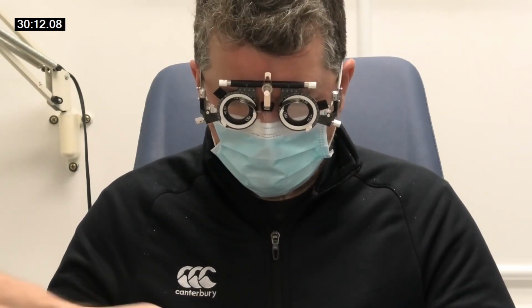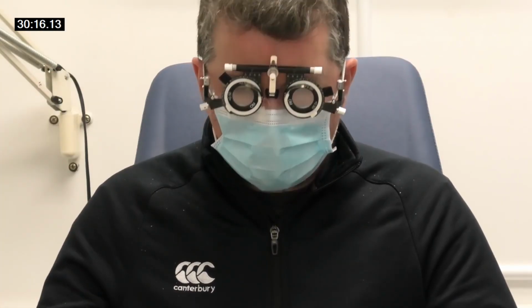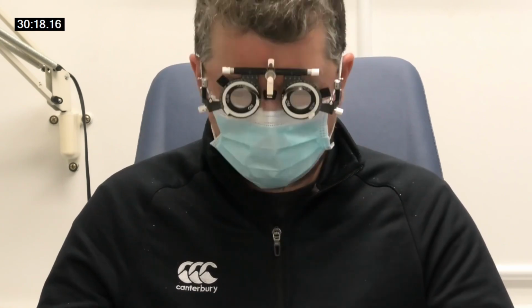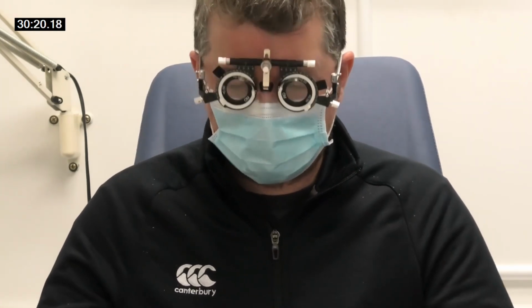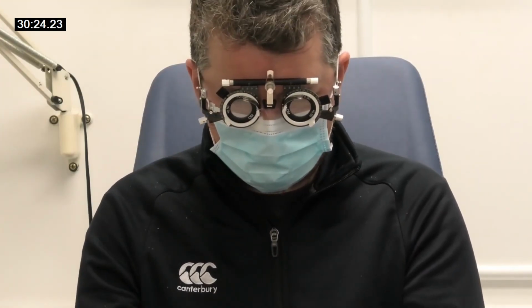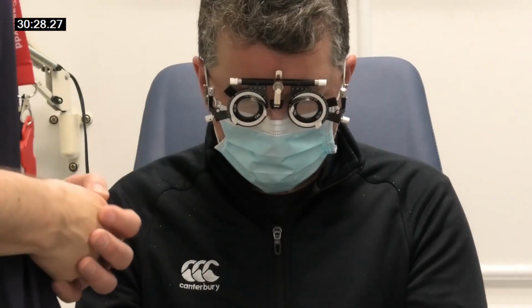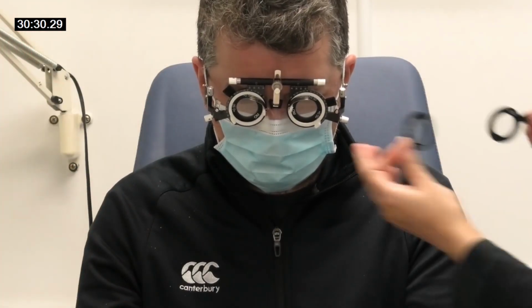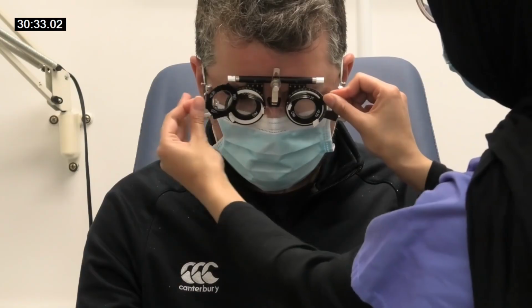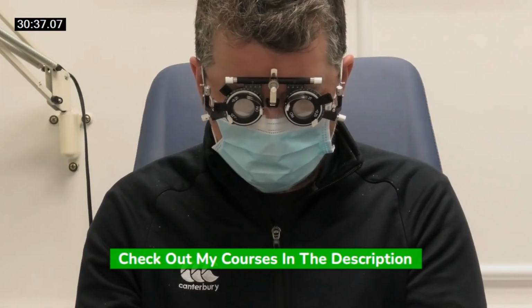And then when you're working, can you see okay, or when you're on the computer? Yeah, I can see fine. I tend to dim the screen. I don't know if that makes any difference, but I tend to have a dimmer screen or a brighter screen. Yeah, so if you just hold it here, plus 50. I mean, the thing is, he's sort of on the borderline, isn't he, needing an add? So just put it in half and just see what happens. Does that make any difference? I think it does very slightly.